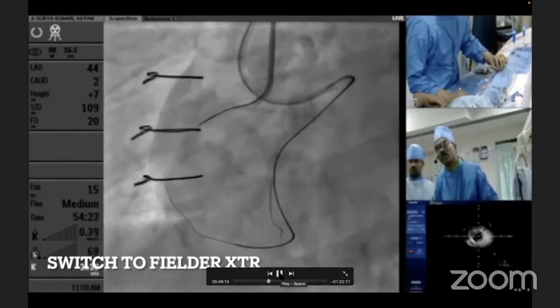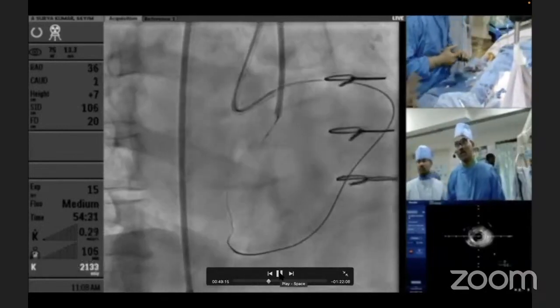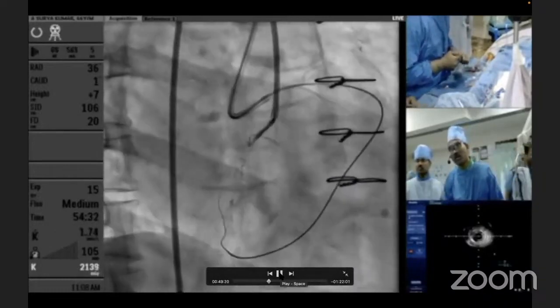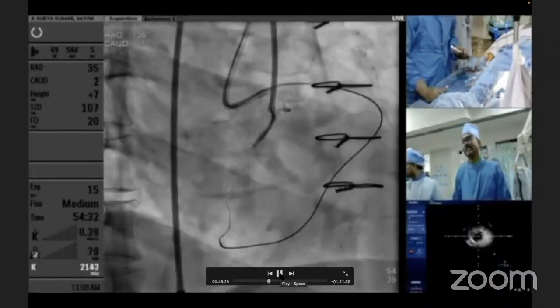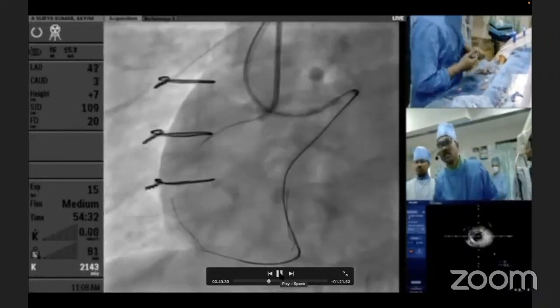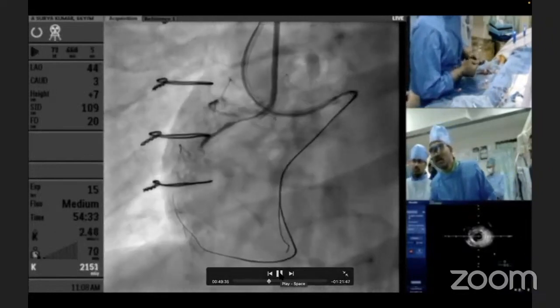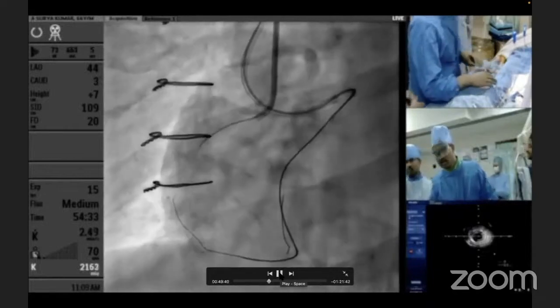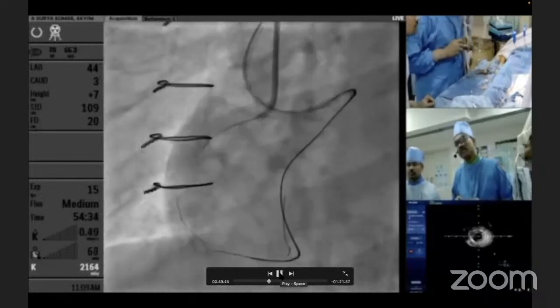Now we will realize, and okay. Now you can see both are in different directions. But still different. Now you can see your RCA is dancing separately from your retrograde wire. But it's not anterior, it's posterior, the wire. Yeah. Basically here the graft is laid, I think it just went into posterior. Posterior, yeah. It all depends on how the surgeon finally lays the graft in relation to the AV groove.